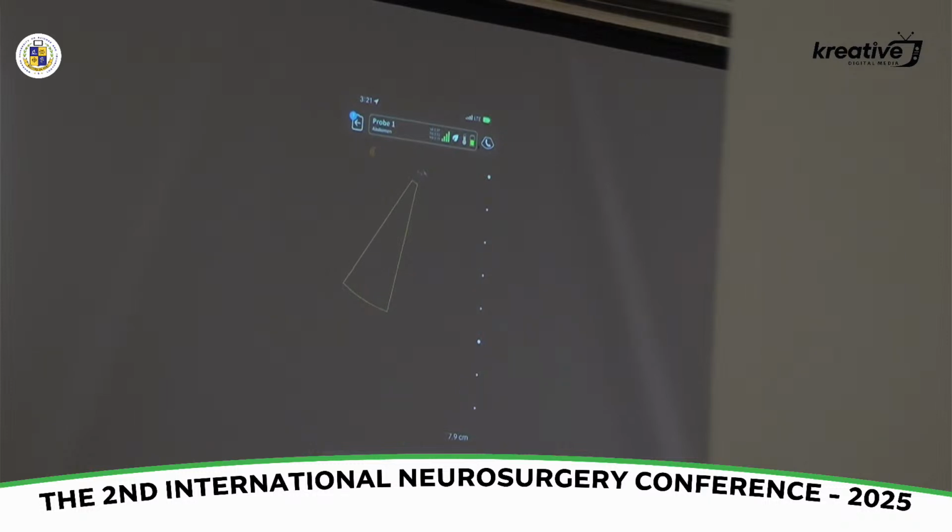Now we'll try power Doppler if it works. You know how many hertz? I think it's 1 to 5. 1 to 5. Okay. If you can set it, what can we set it in, 2 or? I don't know if it gives you that. Okay.